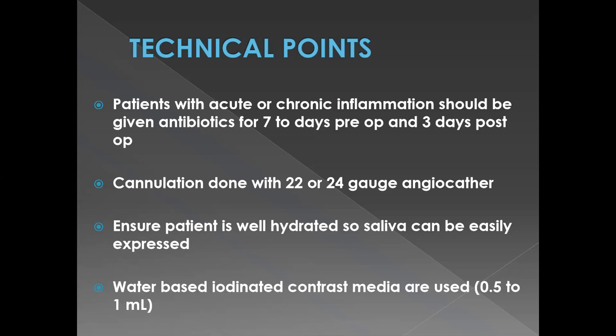I think I'll probably have to share a video of the technique, so probably you'll have a better idea of how it's done. But I'll try to explain it here the best as I can. Basically, the first step is that you have to locate the orifice of the gland, like the Stenson's or the Wharton's duct. We can locate that first just by clinical examination.